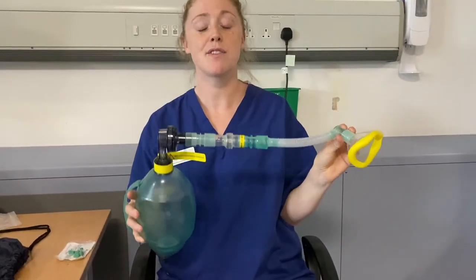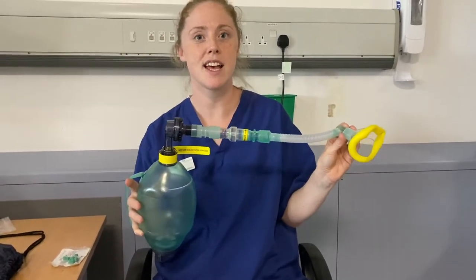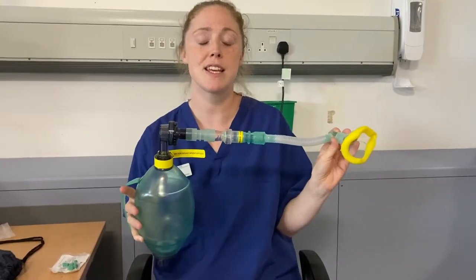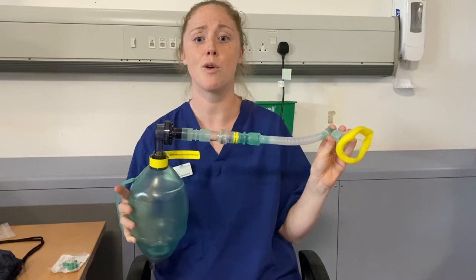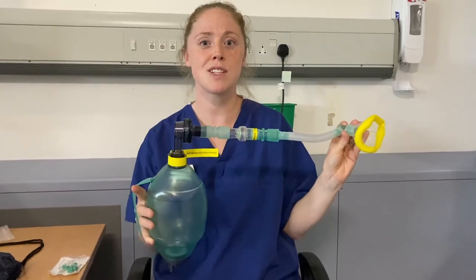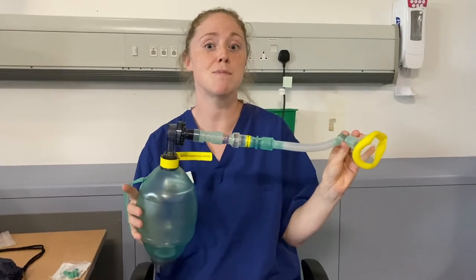After assessment, your physiotherapist may choose to use the Lung Volume Recruitment Bag to help you to take a bigger breath. When you're unable to cough, this can sometimes be due to the inability to take a series or one big breath. The Lung Volume Recruitment Bag will be used to give you a series of breaths, one after the other, to give you in total one large breath, which will help to make your cough stronger.